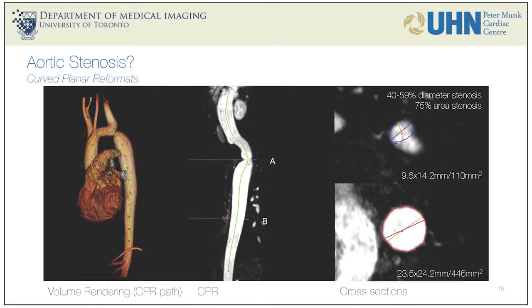Another case here where we're not looking into aneurysm, we're looking into stenosis. In case you see that here, you see a nice coarctation here, typical location. Those stenoses are typically very short. It's just like a waist here, which is actually very hard to measure in case you do those reconstructions.